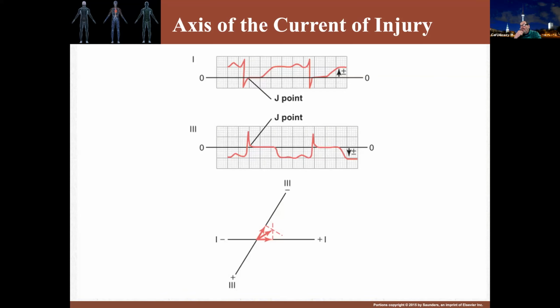So here you see how this is going to be applied. Here we have our QRS. Here's the S wave here. This is our isoelectric line here. Our isoelectric line is up here, the line which is our normal baseline. But our J point, notice, is down here.